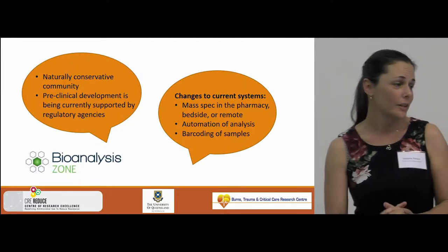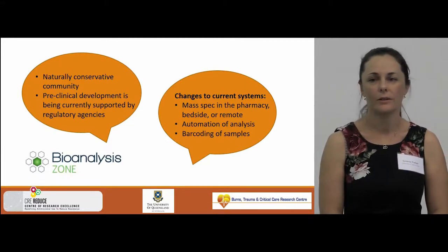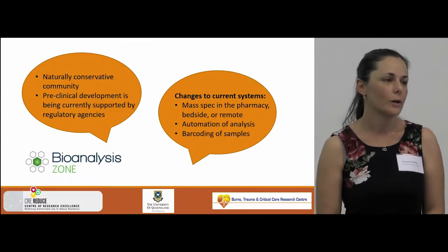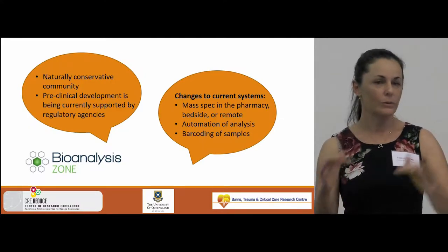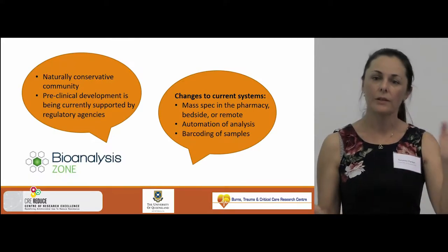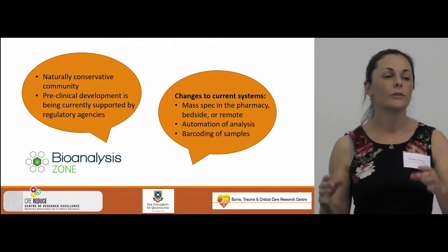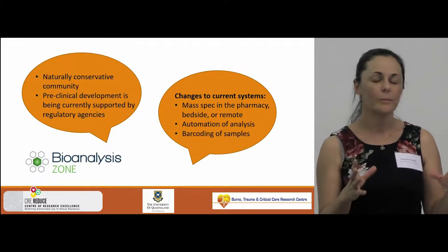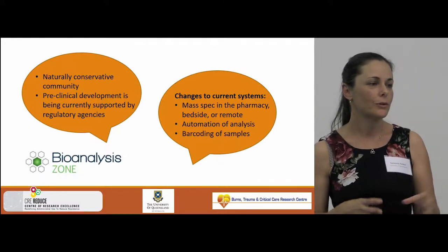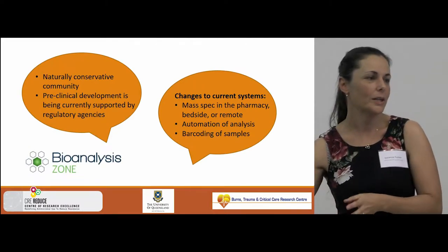They commented that we're a naturally conservative community, and so I think maybe 5 to 8 years ago, there felt like there was a groundswell and people were going to push forward with microsampling. Certainly, there's a lot of work on dry blood spots back then, but what you see now is that it's really pulled away in the literature. Preclinical development is moving forward, and you can see the percentages of studies coming through now using microsampling are in the preclinical development area. Clinical research has really dropped away, and part of that might be not understanding regulatory requirements, because there isn't a lot of information out there, but also trying to work out how to adapt a study for microsampling when we're trying to compare to plasma.